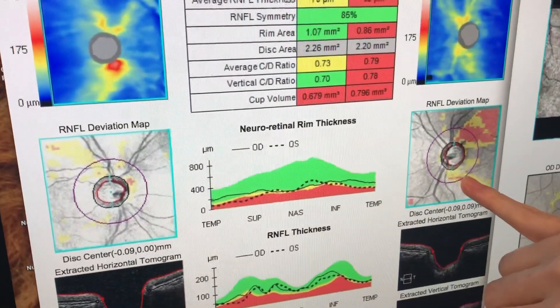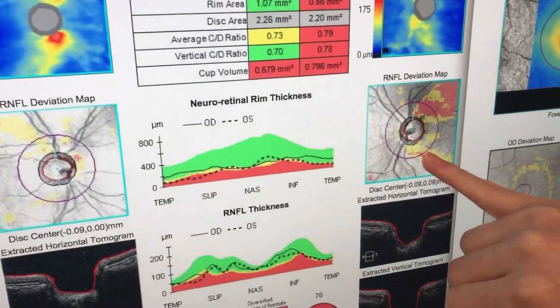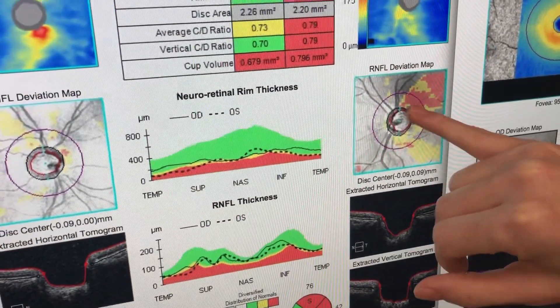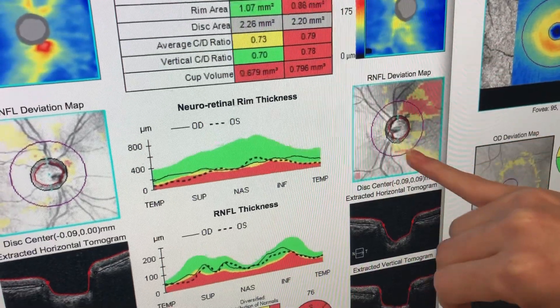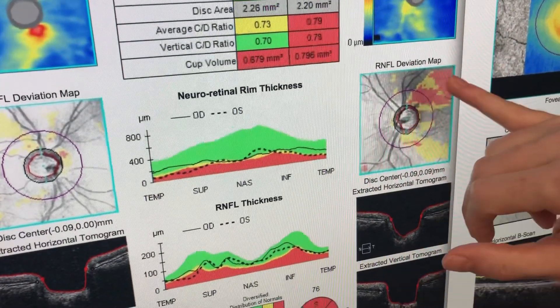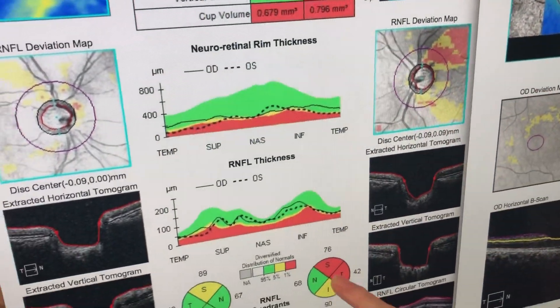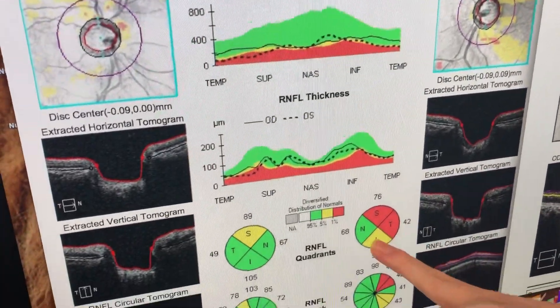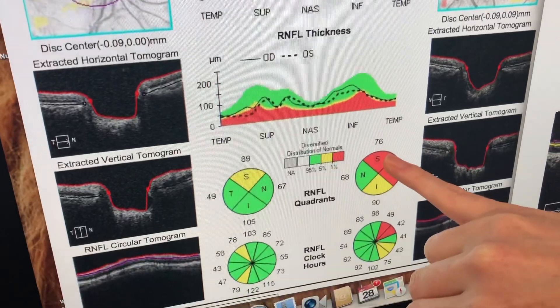When we look at the left eye in particular, we're seeing some superior and inferior thinning indicated by the red and yellow, which correlates down here as well.